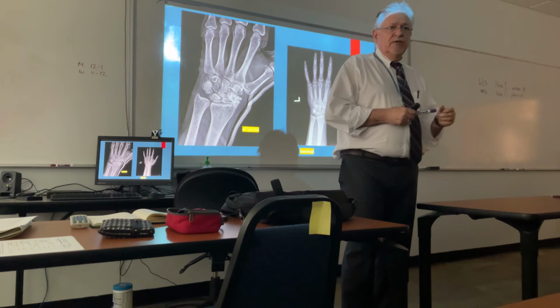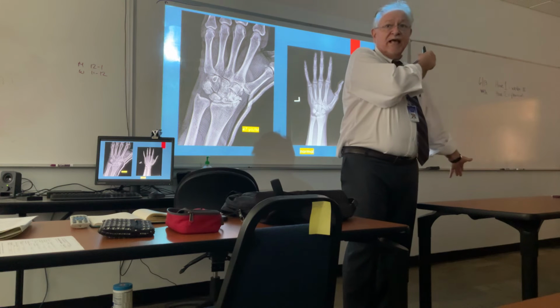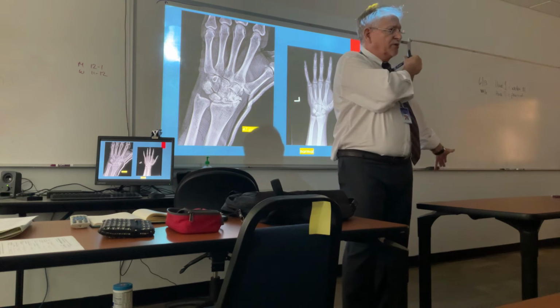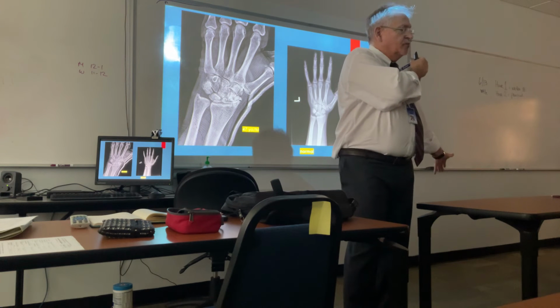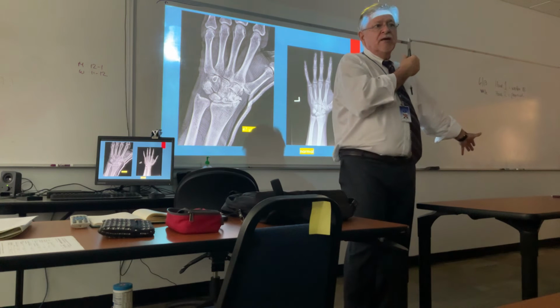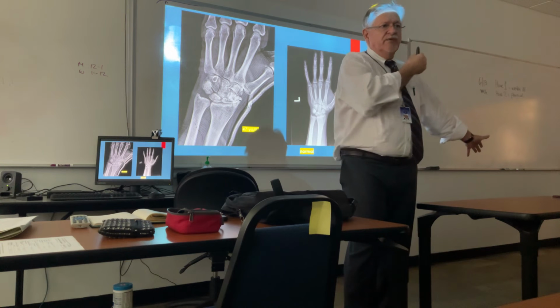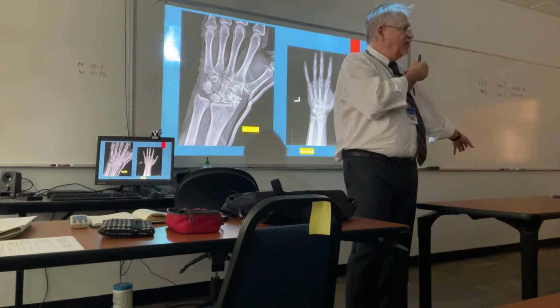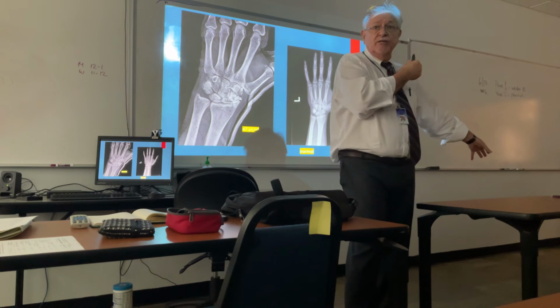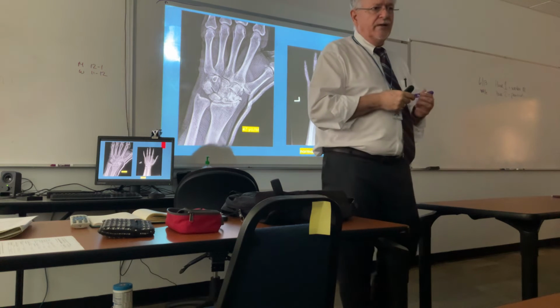Now, little people, they fall off their skateboards, they fall backwards, the forces come up, and it's the clavicle that's commonly injured. Okay? So what did we say about shoulder x-rays, portrait or landscape? Landscape. That's why you want to see the entire extent of the clavicle. Now, the pattern is you'll get mid-clavicular fractures rather than sternal end or acromial end, but that doesn't matter. And if you can't see something and the patient persists in having pain, you can say to them, I'm going to shoot a clavicular spot view. Okay, and then you'll see the underside or the superior surface depending on what happened.